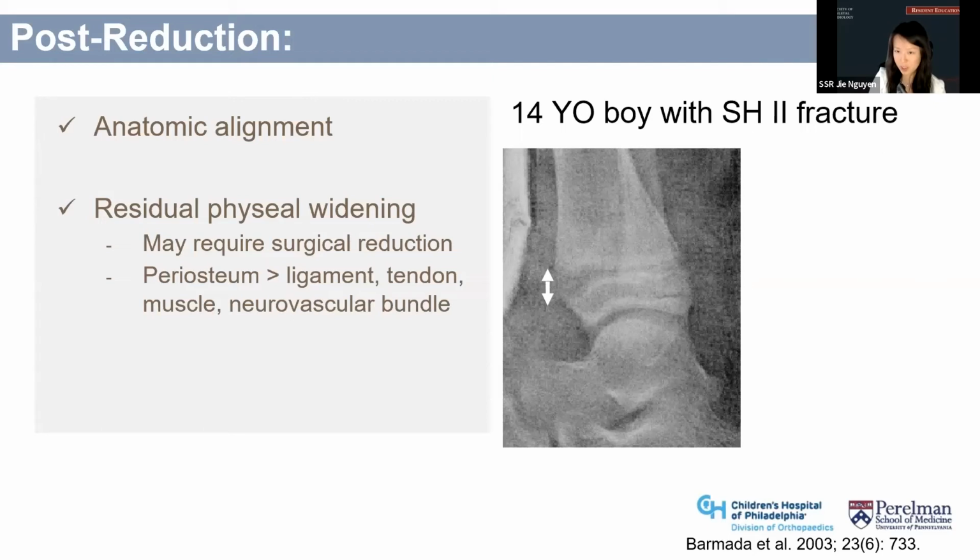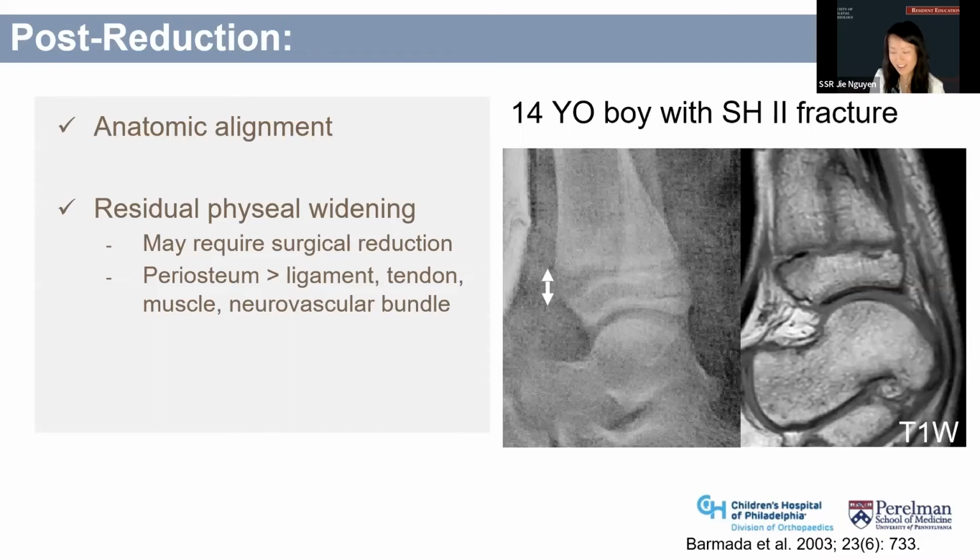For this particular patient, luckily underwent MRI. I guess it was a quiet night. You can see the torn periosteum right here. So it is a metaphyseal periosteum up here that got torn, and the fracture opens up, this falls in, and then it bounces back as if the alignment looks really good, but this piece is inside. And the periosteum has propensity to form bone, right? That's what it's supposed to do when you have a regular fracture. So this will be concerning that it will form a bony bar.